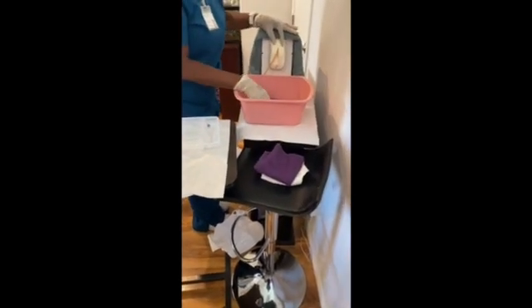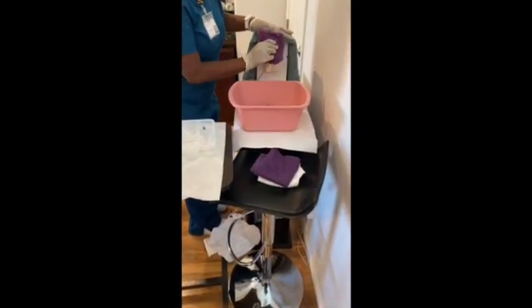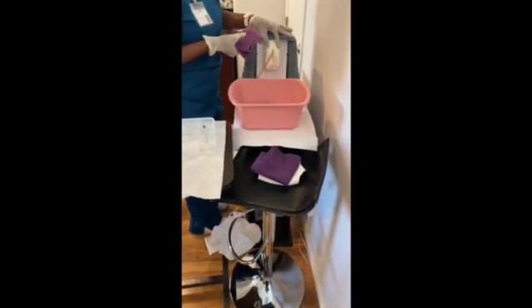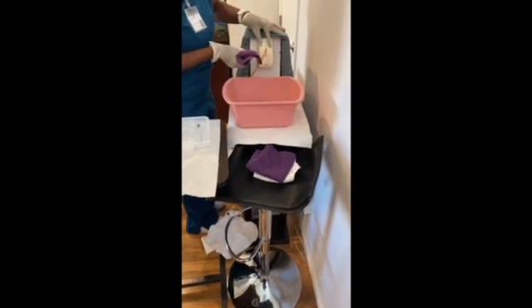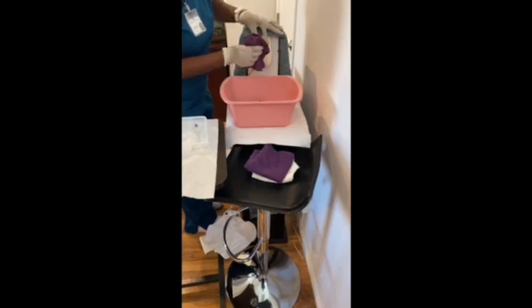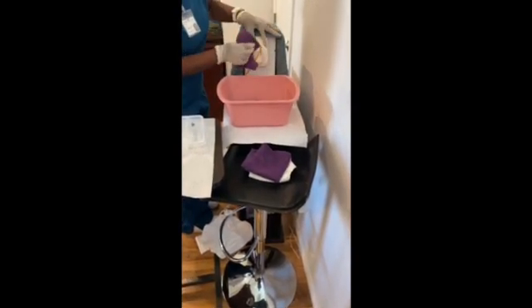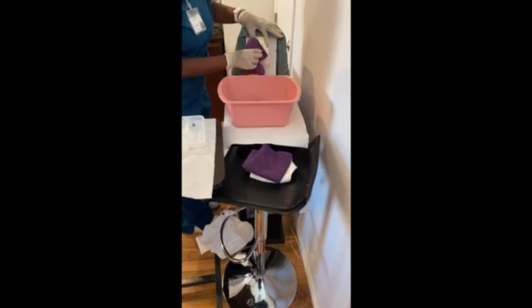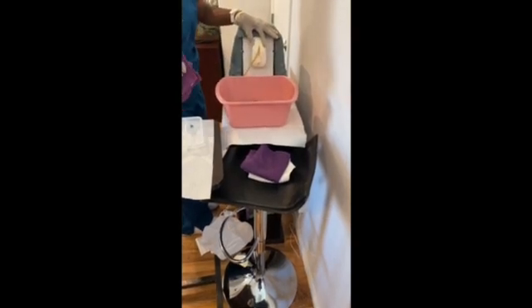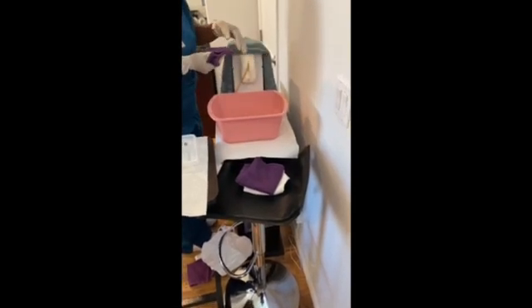We're gonna just continue cleaning the patient, all the iodine that is on. And that goes in the laundry bin. And then one swipe down the middle.